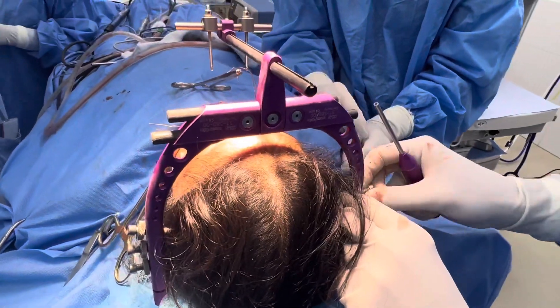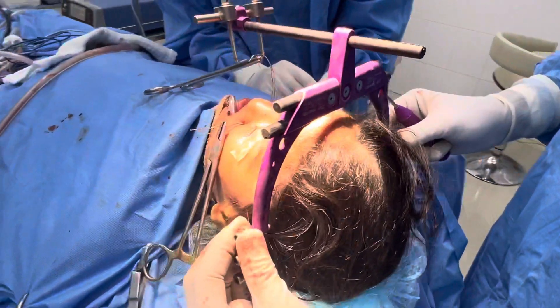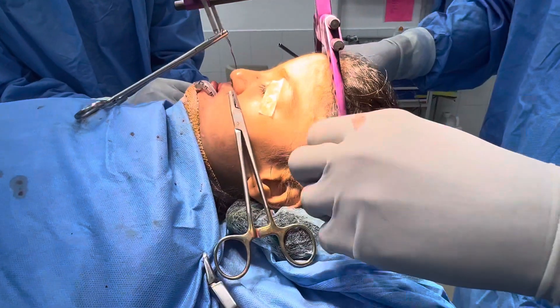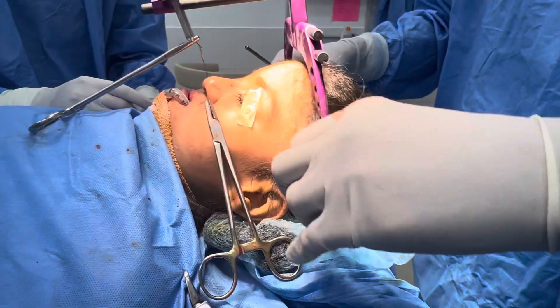This is just to make sure that it doesn't unwind and come back. When you want to tighten it, you want to loosen it first and then tighten it. A little more.